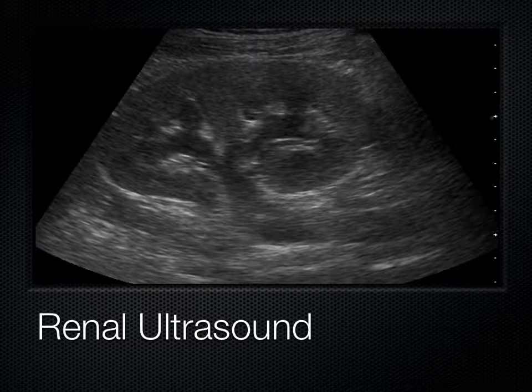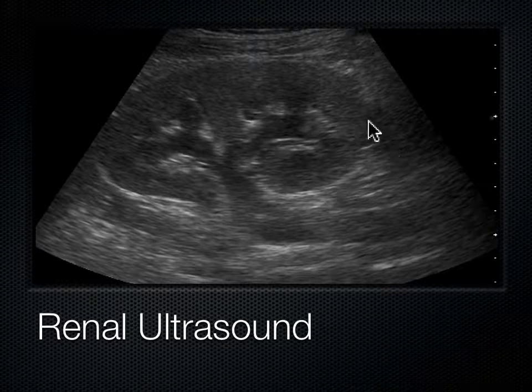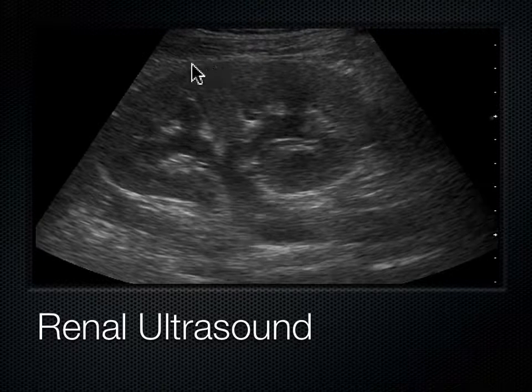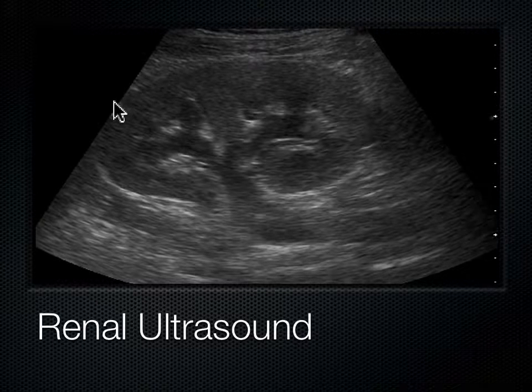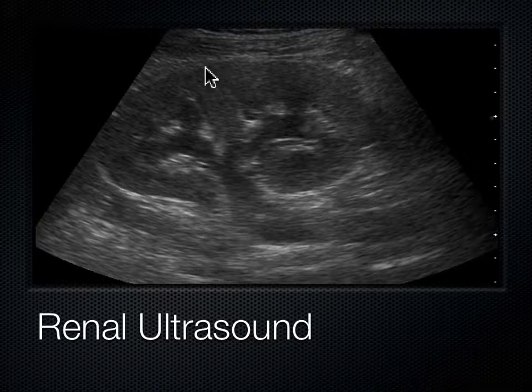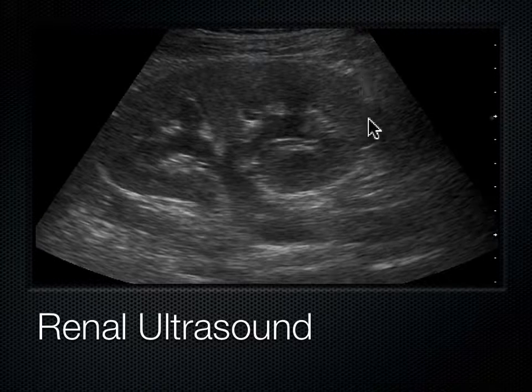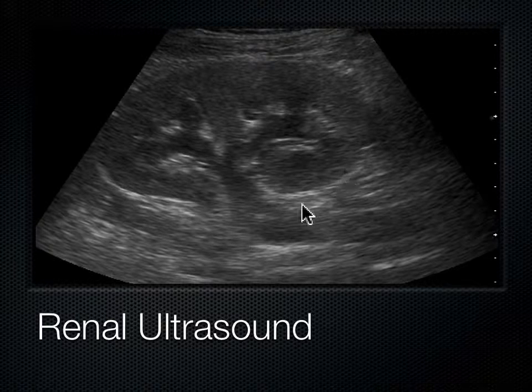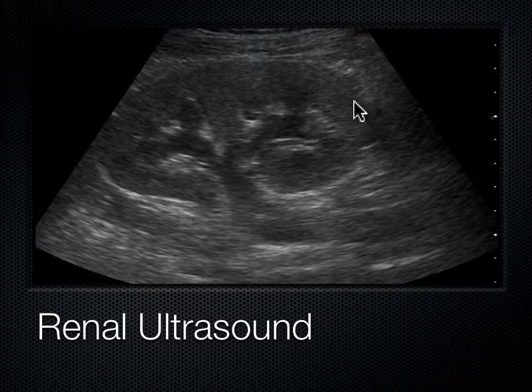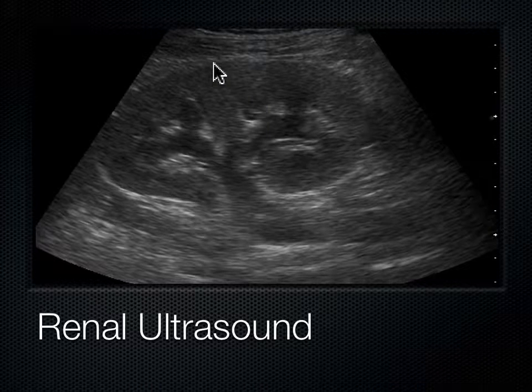You can tell from this image right here, this is a kidney. The kidney has some anatomy I'll go over. This is the capsule of the kidney out here. It's a very thick fiber structure, and the capsule does not allow the kidney to expand very much.